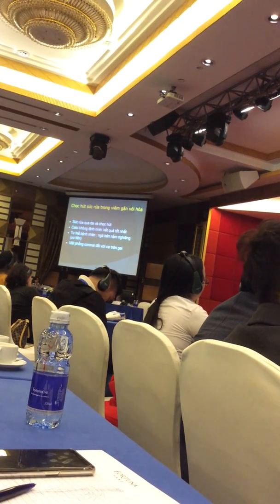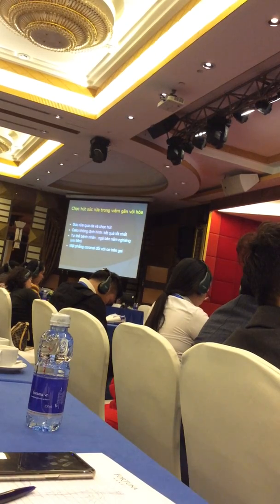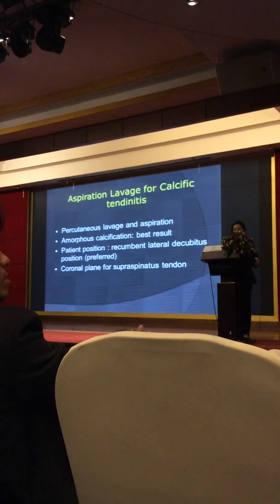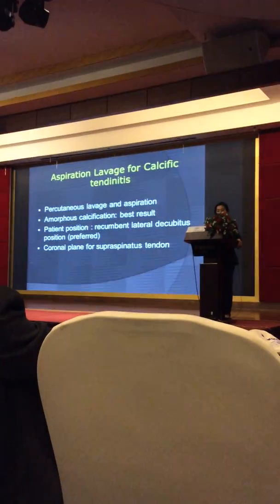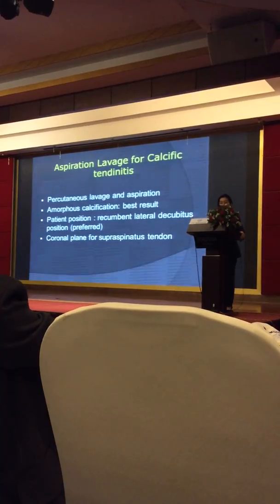Aspiration lavage for calcific tendinitis is another very common procedure done in everyday practice in Korea. You can do percutaneous lavage and aspiration. Usually amorphous calcifications yield the best results.